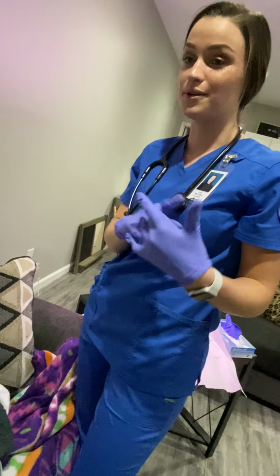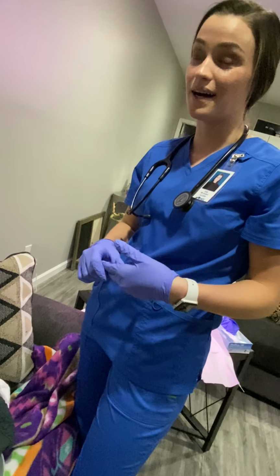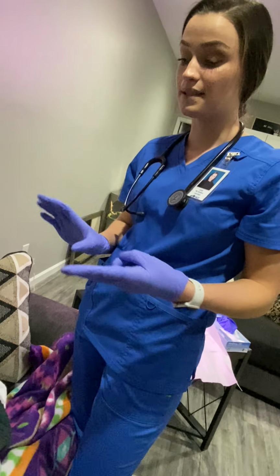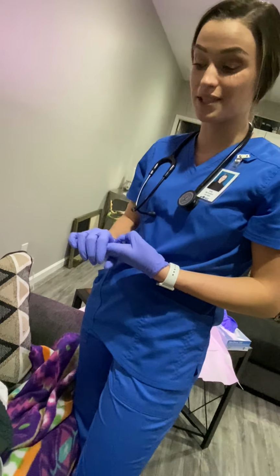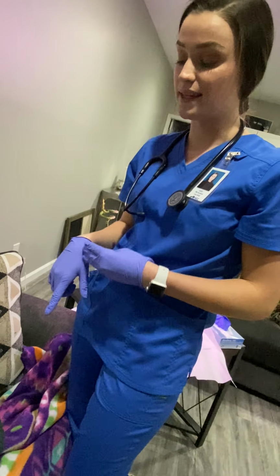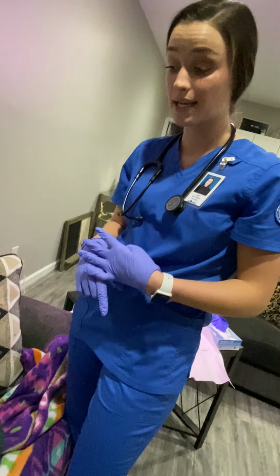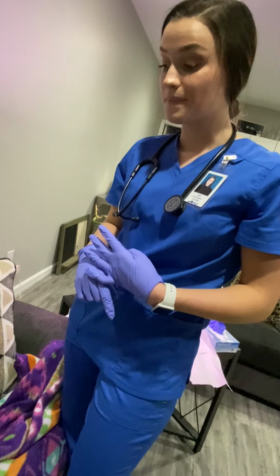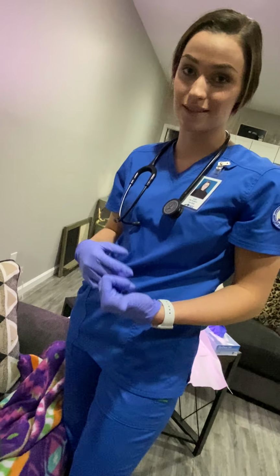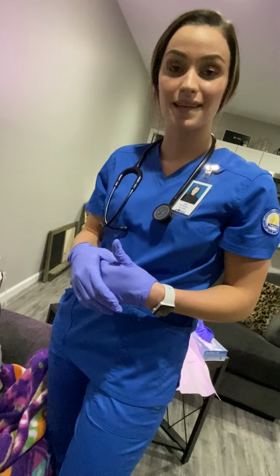And then I will document which naris I put it in, how I secured it. I'll put the distal end of where the location of the NG tube is, and then I'll also document the pH of the gastric aspirate and the feeding rate or suctioning or whatever the physician ordered. I'll document that. And that is it.